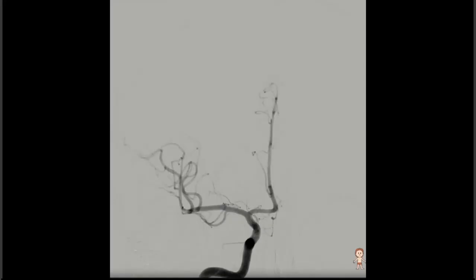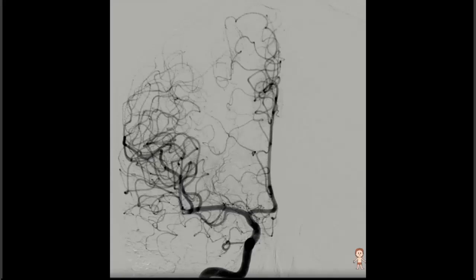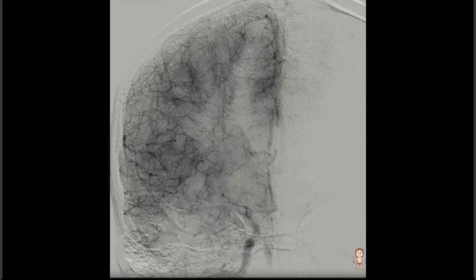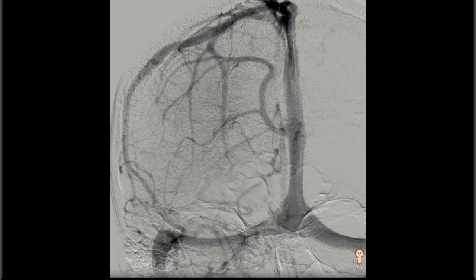Now we're going to look at an angiogram where contrast dye is injected, in this case into the internal carotid artery. And we can see as each image sequence progresses that we have the internal carotid artery and it branches to the middle cerebral artery and the anterior cerebral arteries until it perfuses all the way to the much smaller vessels, and then ultimately returns via the venous system. We can see the various venous sinus structures as the dye is now exiting the head.